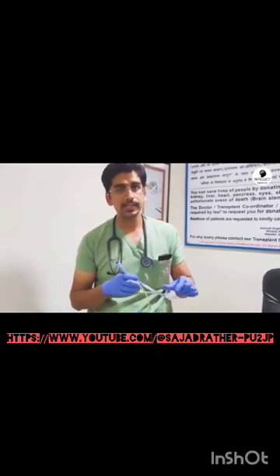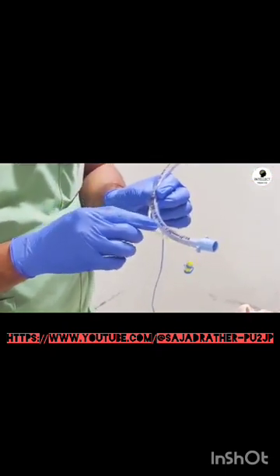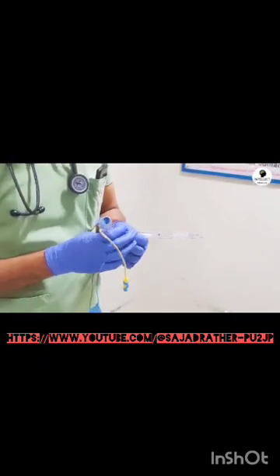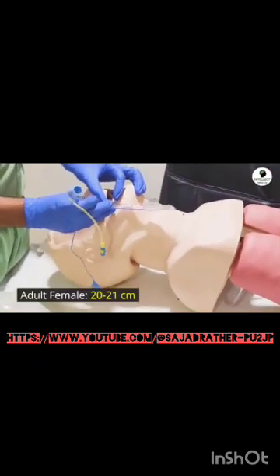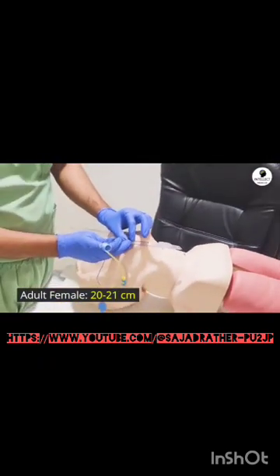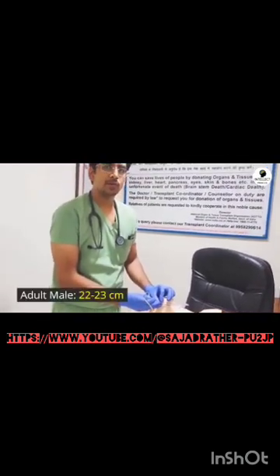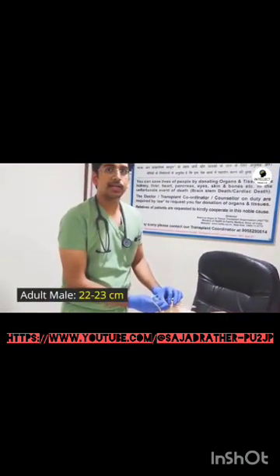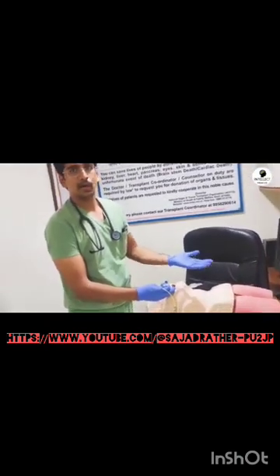Now talking about the depth, how much you need to insert this endotracheal tube. There are various marks as we discussed: 18, 20, 22, 24, 26. When you are inside the trachea of a patient, in an adult female, we prefer to fix at the angle of the mouth around 20 to 21 centimeters. Whereas for an adult male, we prefer to fix at 22 to 23 centimeters.